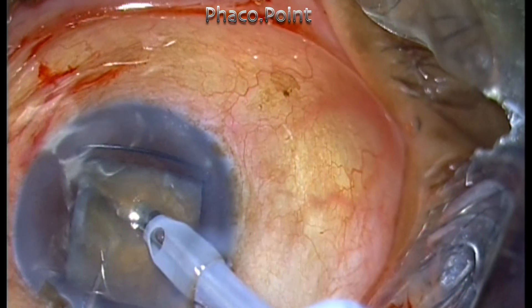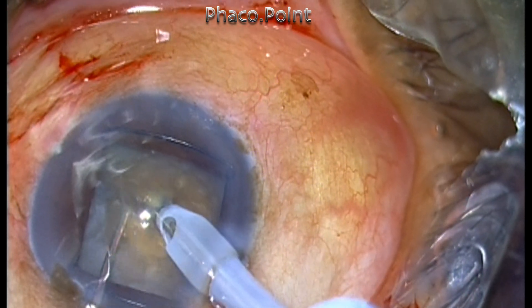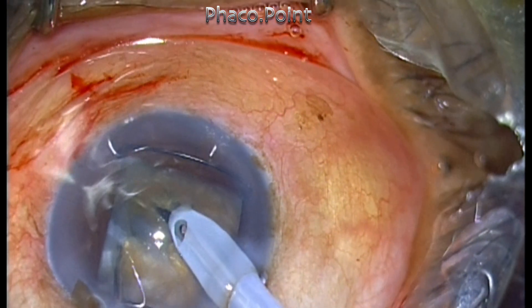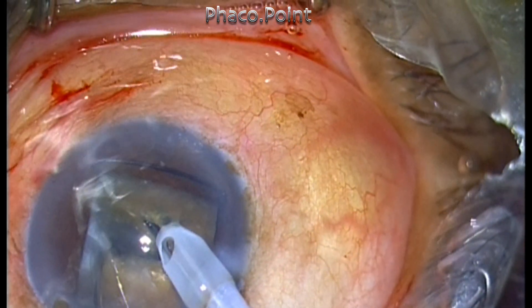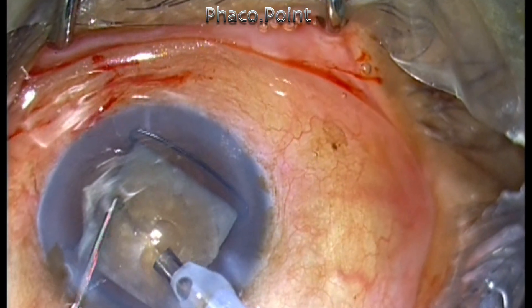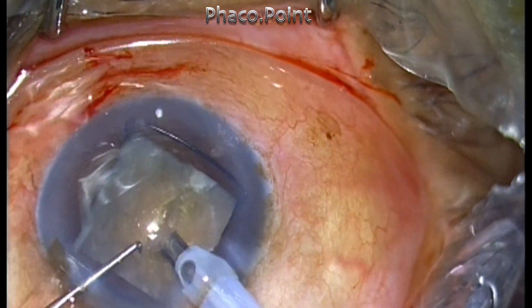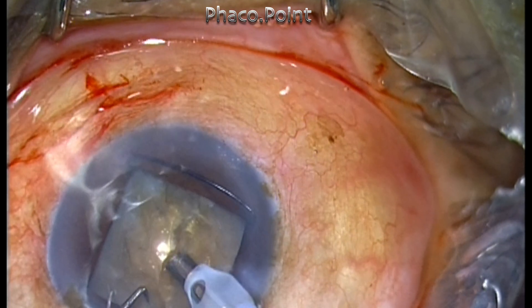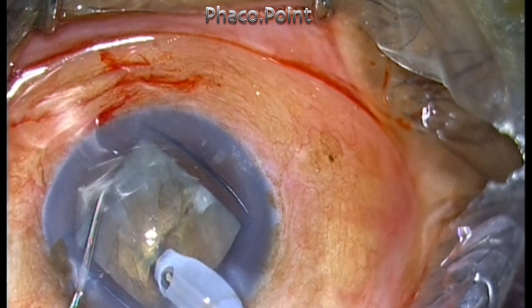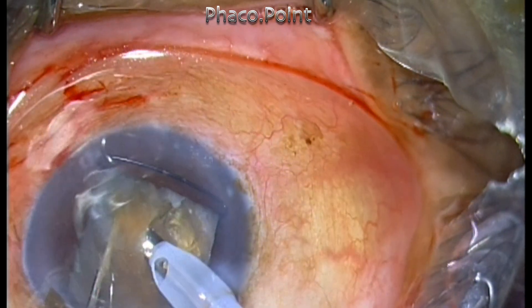The tip of the phaco probe has been exposed to almost two millimeters — this is what I do when handling hard cataracts. I'm performing phacoemulsification using a multi-burst mode. The power in this case is just 40% with a burst duration of 30 milliseconds and a duty cycle of 75%. I'm going to perform sequential phaco chop, where the pieces are created on the go and removed as they are created.